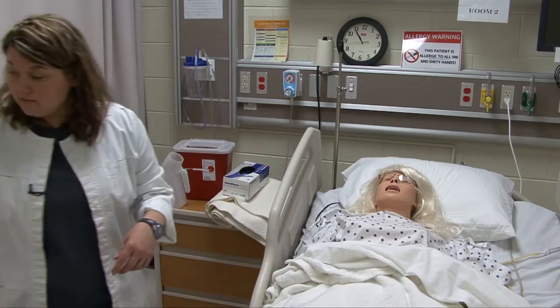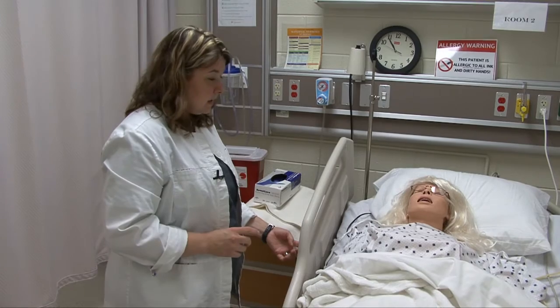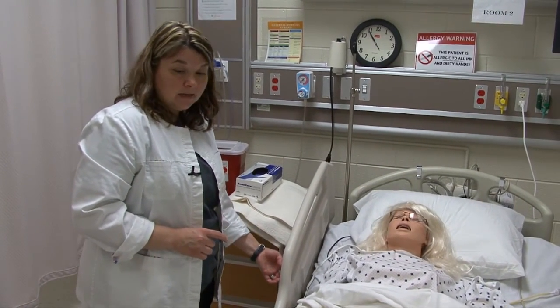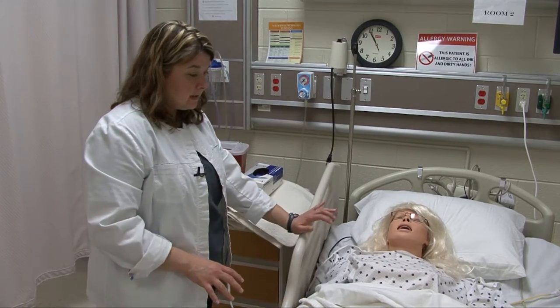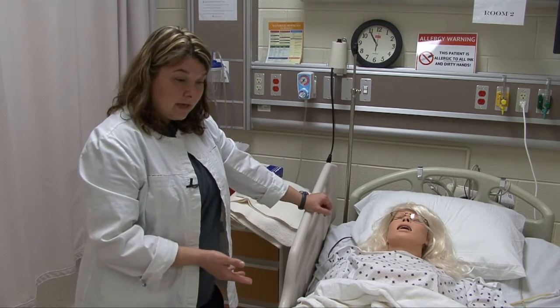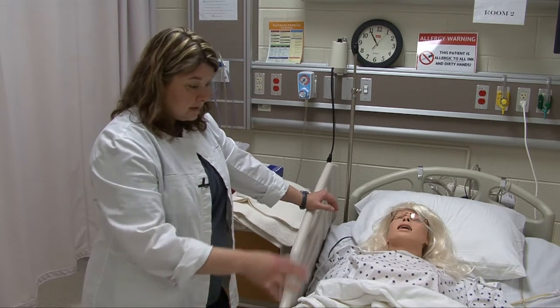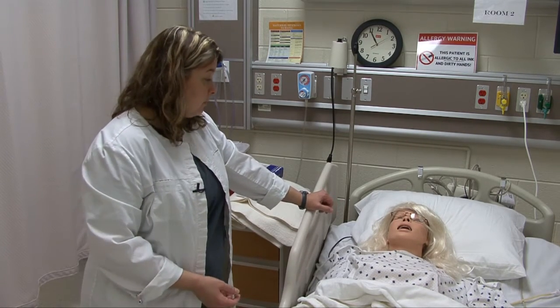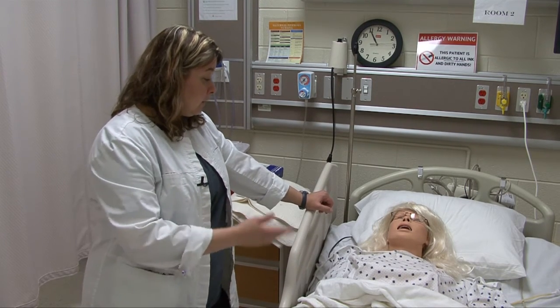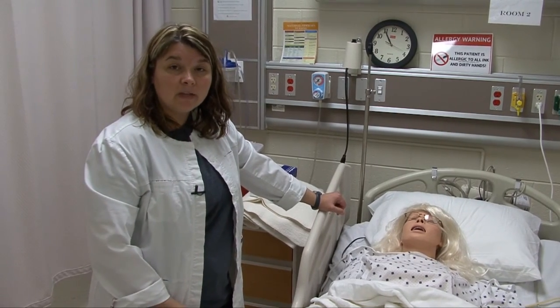I foam again, having completed teaching and explained everything to her. I lower her bed and ensure safety: bed is low, locked, and not moving. She has her call bell within reach. I ask if she's having any pain and if she needs to use the bathroom. I make sure she's in a comfortable position and return her table and belongings within reach. I thank her for allowing me to care for her, clean up my equipment, and exit the room.